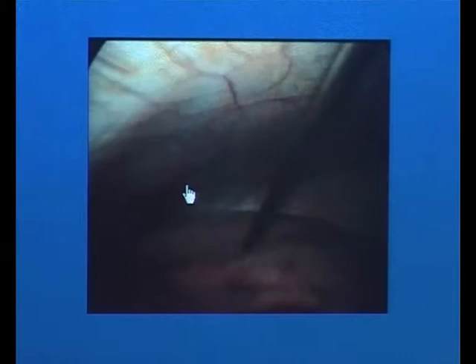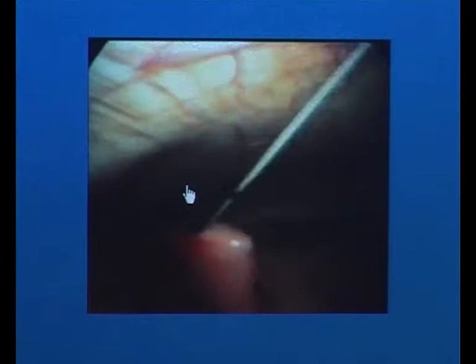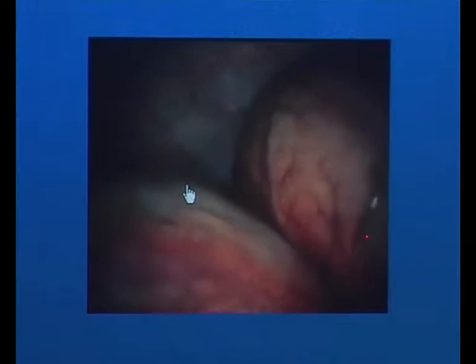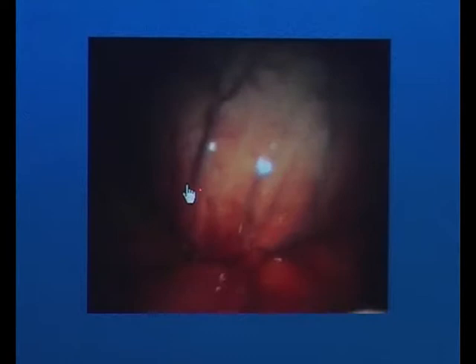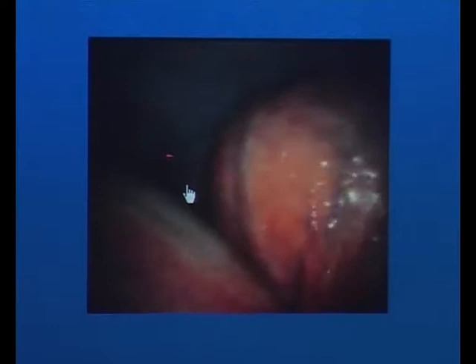You can see the mark, and if we pull the thread end a little bit, you can see the toggle in the lumen of the abomasum. And you see here the omasum, and behind the omasum we would expect the liver. Now we have a contraction, and now you can see the liver here in this direction. Yeah? The correct position of a not displaced abomasum.